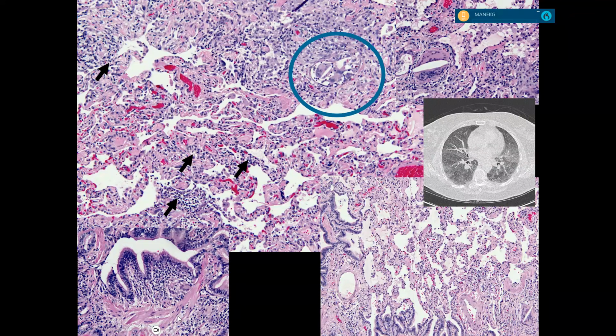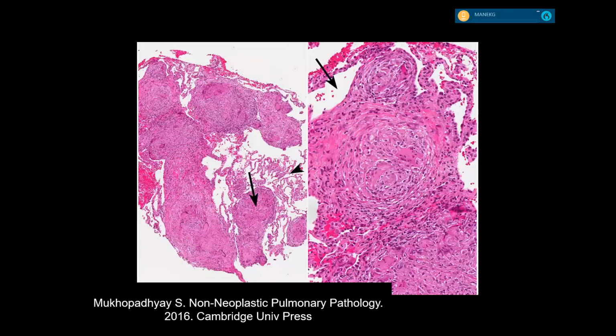Perfect HP. Actually, frankly, you don't need the histology with that kind of CT. That is sick. It used to be called head cheese, and now do you know what it's called in the new nomenclature? Three densities. That's just so that somebody can get a paper. Just skeptical, the cynic in me speaking. Okay, what is this?